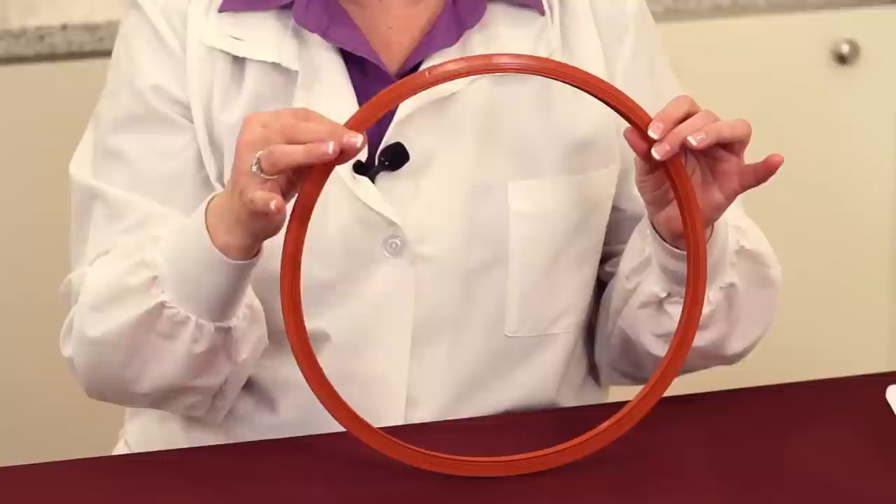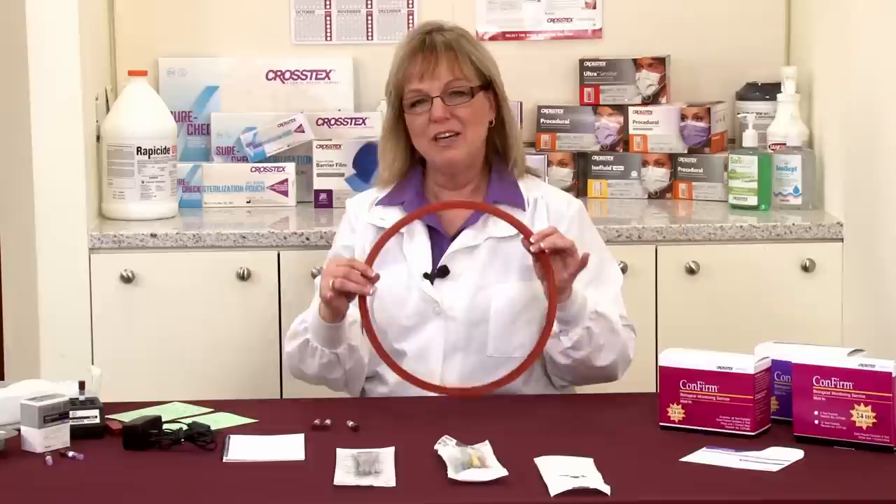One of the first things to look at is the gasket. Do we see any cracks in the gasket itself? Do we see any drying? Do we see any buildup? If that's the case, you may have a poor seal on the door, which could result in poor steam quality.